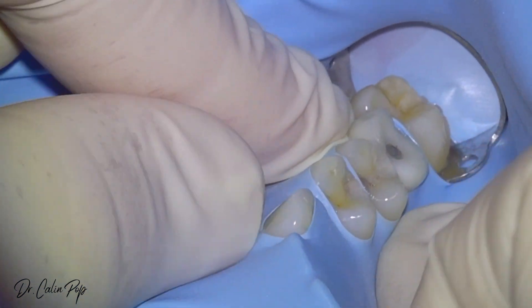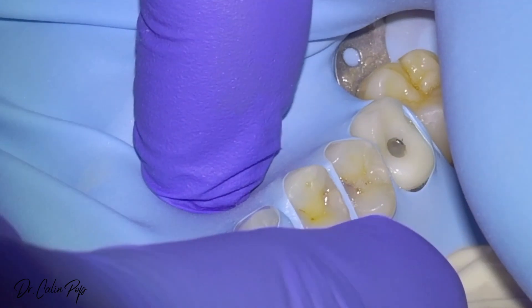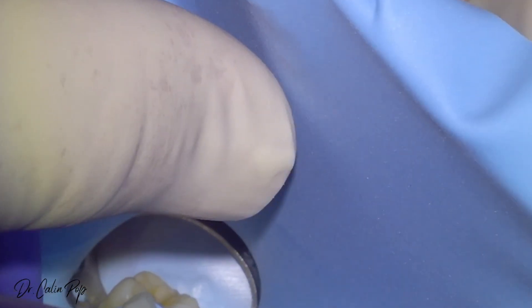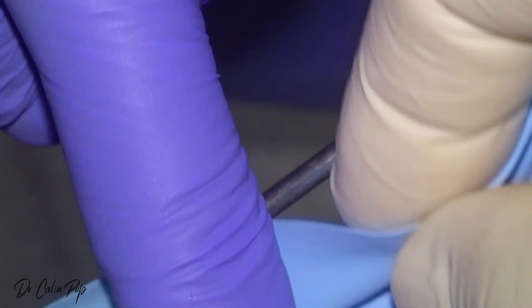Come here, please. Hold. One finger here, one finger here. Hold it. So if you notice there is a tension from the lip — see? Now it's more flexible. So all these tiny, small effects, small things you should consider.